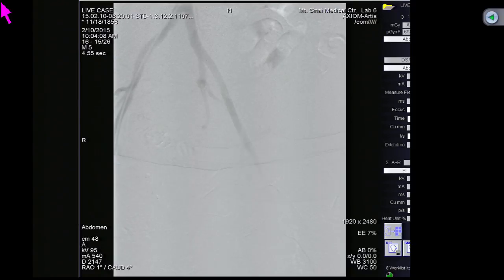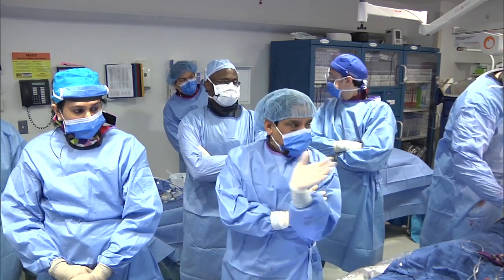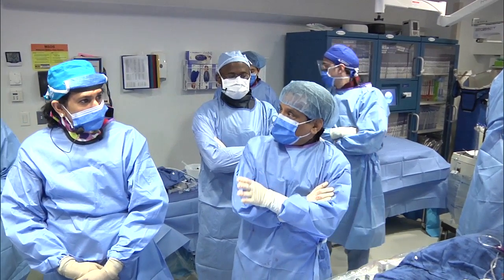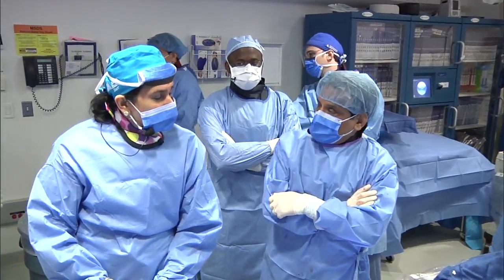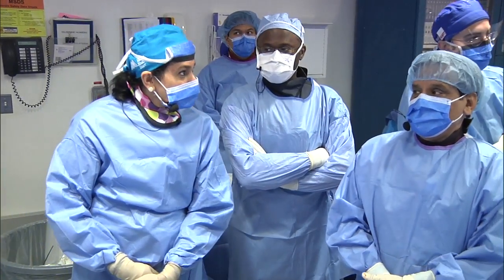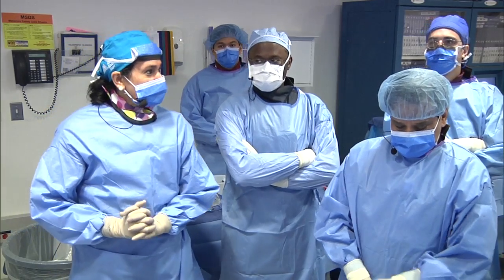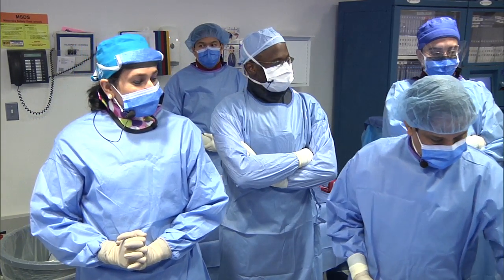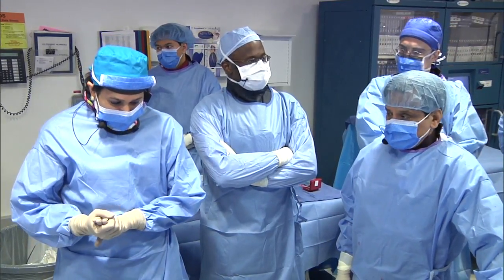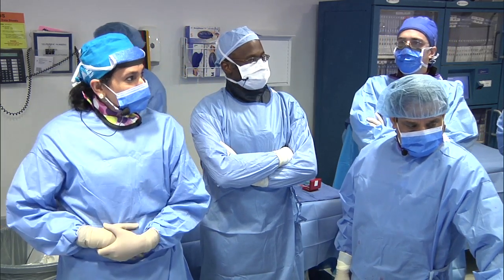Good. I know how you feel now, in this high-risk patient with the body habitus, with the excellent vascular closure now. Right? Yeah. That was our biggest concern in this particular case. I think now we have to make sure your other right side is also okay. Most of the time, people pay all attention to the main access, and any complication or hematoma can happen from the smaller access site also. But knowing the body habitus, when we first saw her, we were always concerned with the percutaneous access, but it looks like JK did an excellent job.